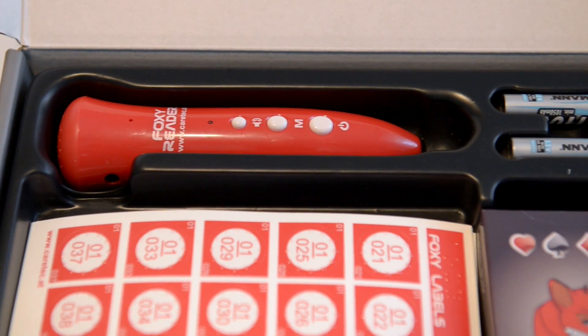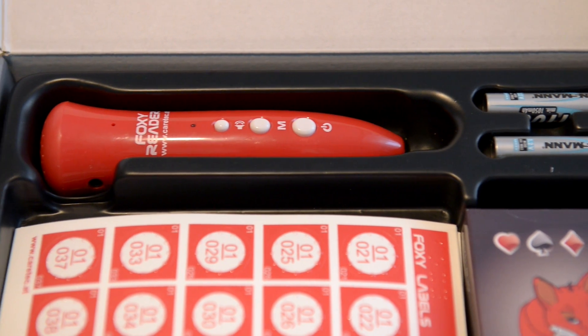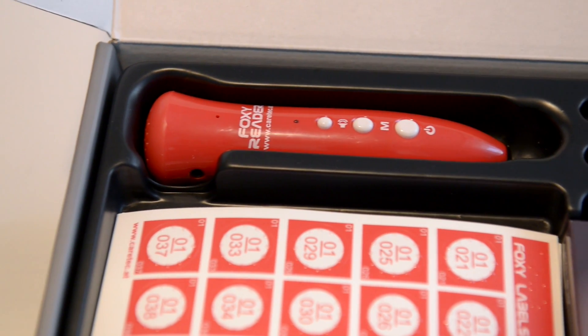The Foxy Reader helps you find your personal things and groceries easier than ever, and you can even play card games with your Foxy Cards thanks to the private acoustic report via earphones. With the Foxy Reader you can also listen to music and record simple notes like your shopping list.